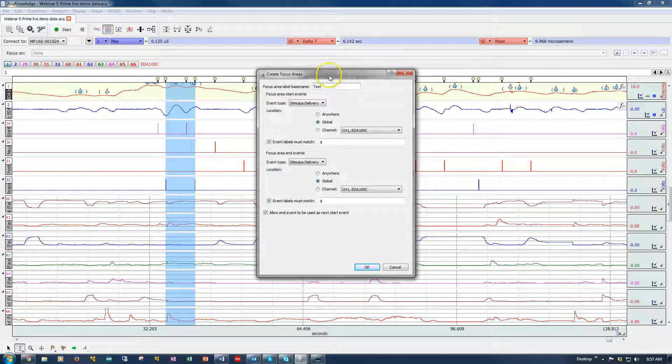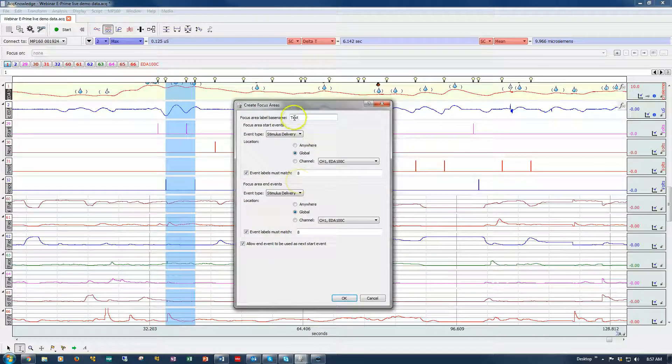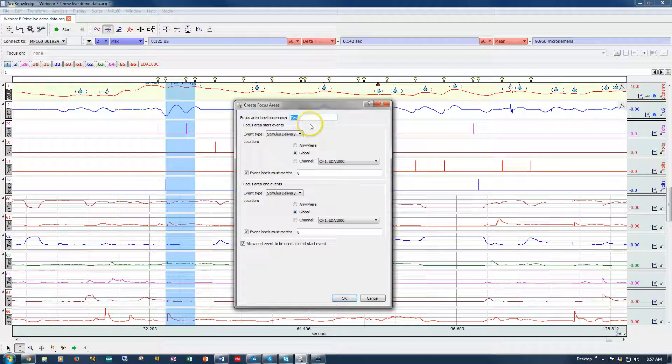It's under the Analysis Focus Area menu and it's called Define Between Events. When you launch that, it will open up a dialog like this.